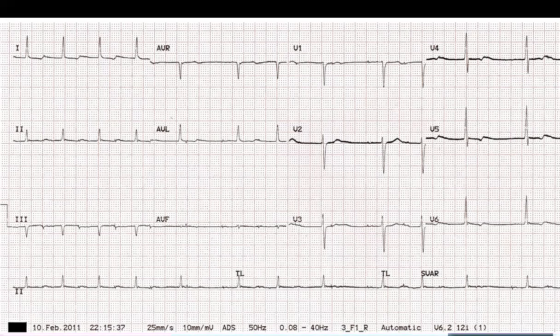Is it a single or dual chamber device? The single, because it is just consistently pacing the atrium followed by a natively conducted QRS. No spike for the QRS, even after prolongation of the AV interval. That is not the problem. The dropped beats are the problem. Usually you would wait for a period of time, but because it's only one dropped beat, some devices would ignore that. We try to make things as physiological as possible.